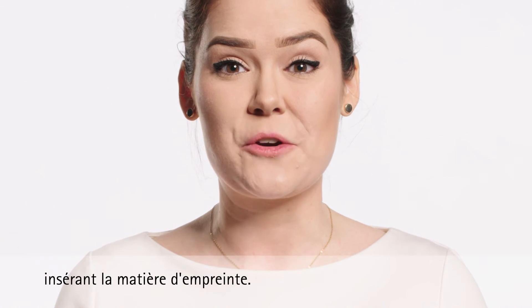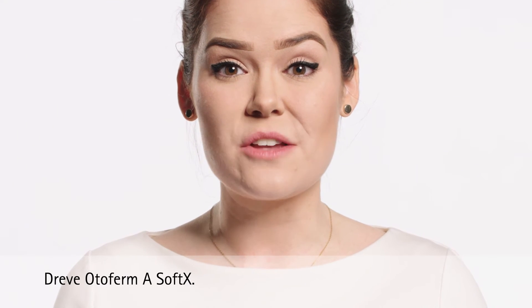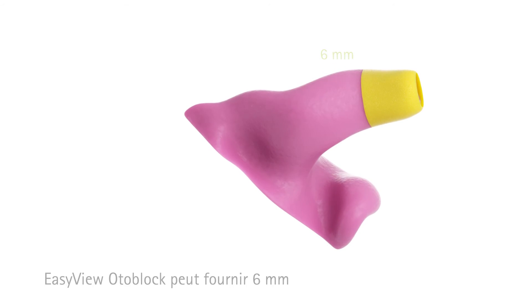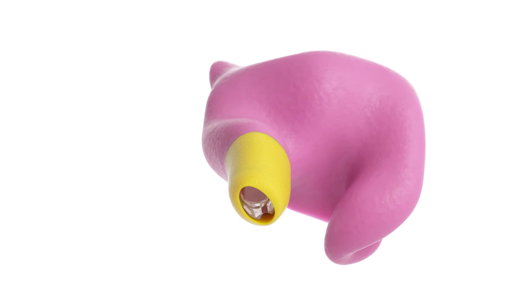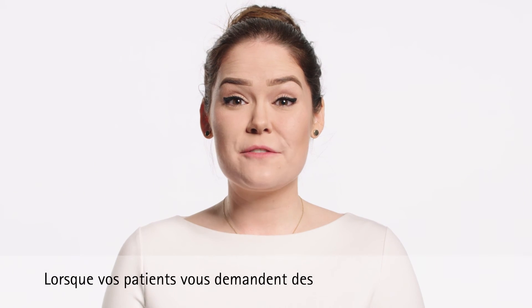The material that we recommend is the Dreve Otoform A SoftX. The EasyView Otoblock can provide an additional six millimeters of information because the Otoblock retains the shape of the canal. This information is scanned at the manufacturer, so be sure not to remove it.